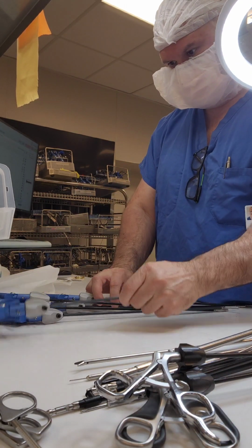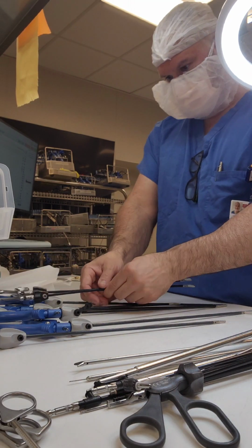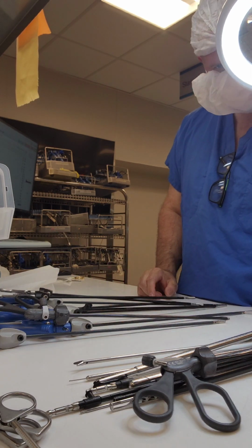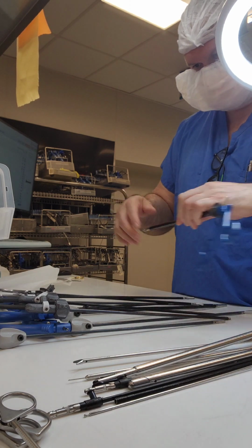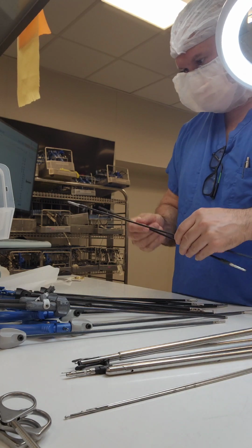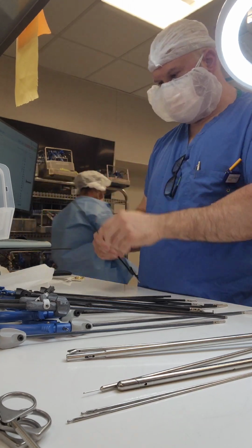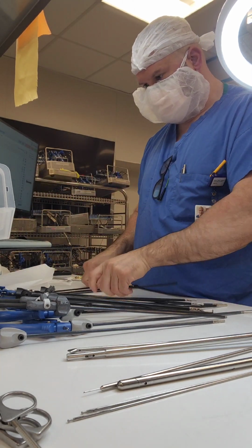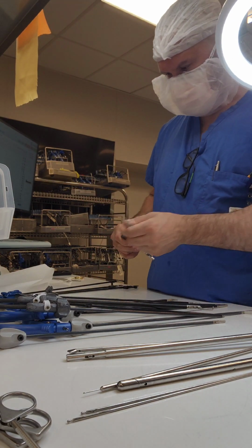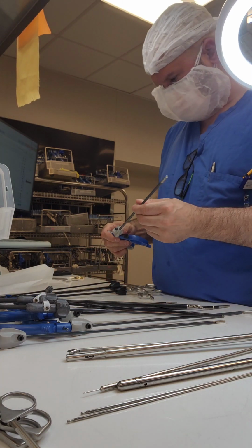All right, here we go with these laparoscopic instruments. Now, here's the part where I tell you, lap instruments, if you looked at my shorter video, require some inspecting. And this had quite a few lap instruments, some single assembled or one-piece laparoscopic instruments, and some that required assembly. So all the insulated ones require that insulation testing, trying to pull that insulation back to make sure that it's not slipping. For the ones that are one piece, you still have to do that test, right? Make sure that the insulation's intact.